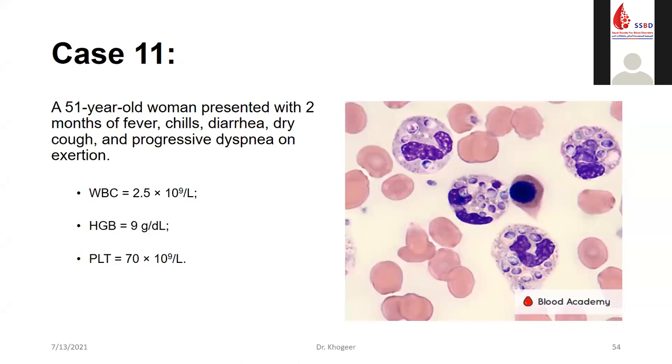How common is it to see lymphoplasmacytic cells in the COVID patient? Sometimes, yes, because lymphoplasmacytoid cells are a kind of morphological alteration in the lymphocyte that correlates with infection, especially viral infection. So again, COVID patients usually present with lymphopenia, so it's hard to find a good number of lymphocytes to go through them and examine their morphology thoroughly.